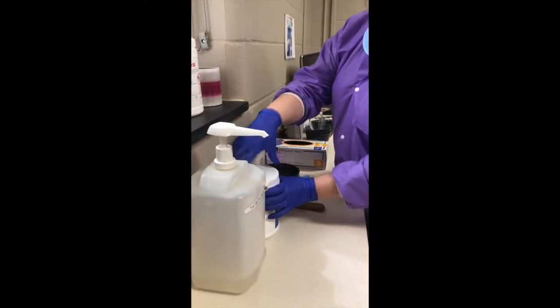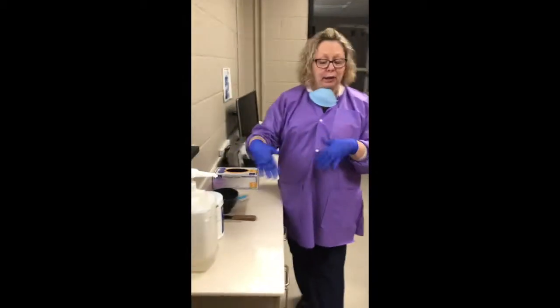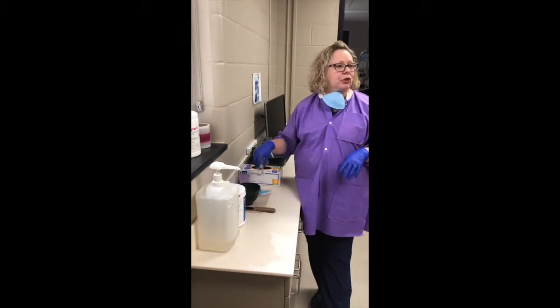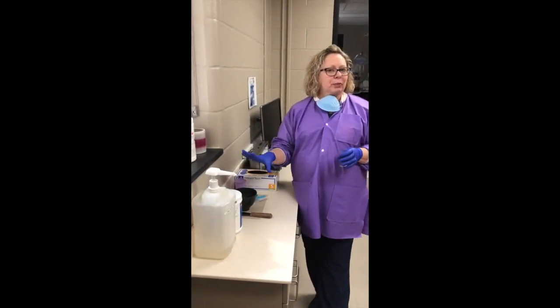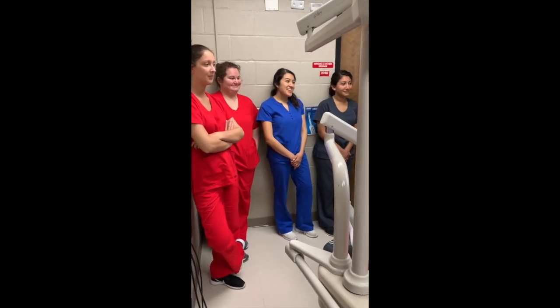It always matches up. And then the other thing is, I have a canister of tap water that has sat, to allow it to come to room temperature. Do you remember why we use room temperature water? It affects the setting time. That's right. You were exactly right.